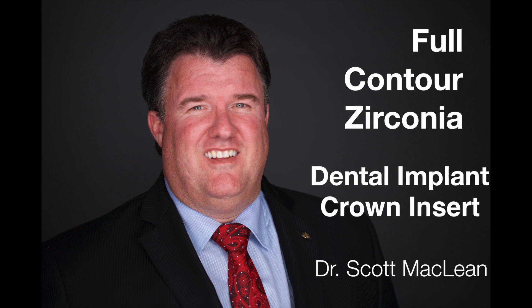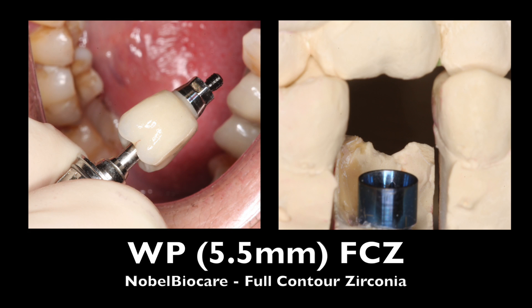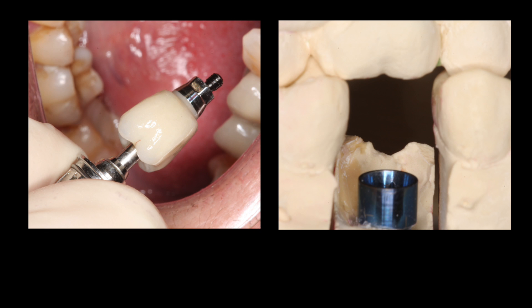This is Dr. Scott McLean and this is a YouTube video about implant dentistry. During this case we'll be inserting a full contour zirconia crown on top of a wide platform implant. Here you can see it's blue, signifying that it's a 5.5 millimeter wide implant with a wide platform connection.